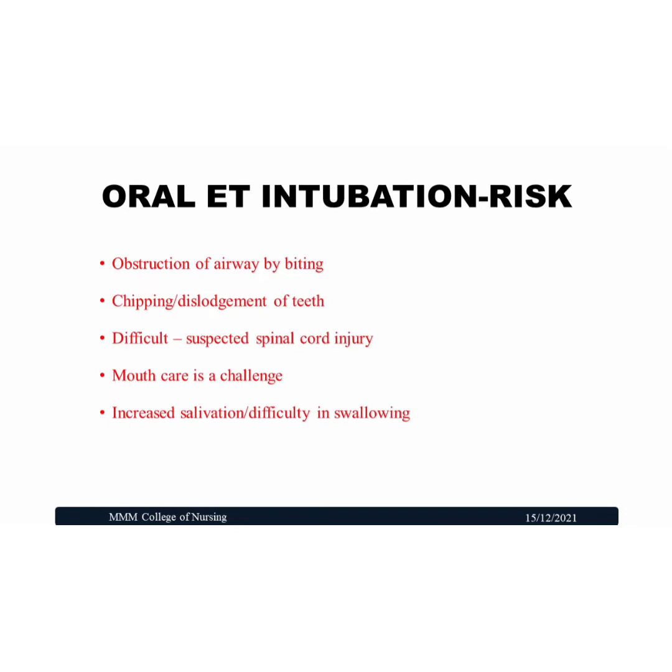Risks of oral endotracheal intubation: obstruction of the airway by the patient biting, chipping and dislodgement of teeth, difficulty with suspected spinal cord injury, mouth care is a challenge, and increased salivation and difficulty in swallowing.